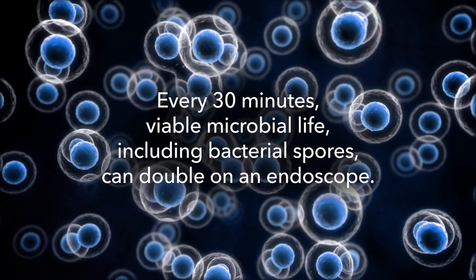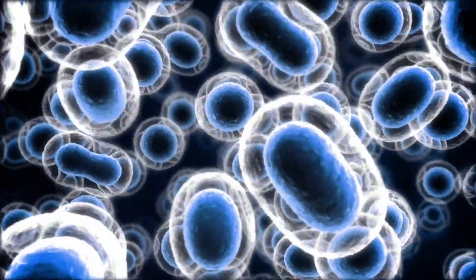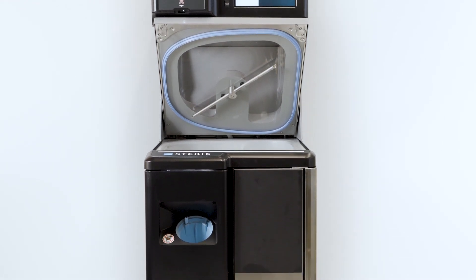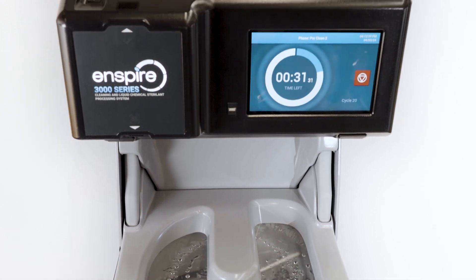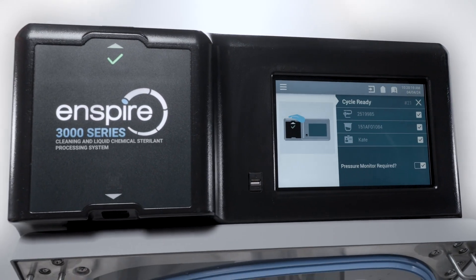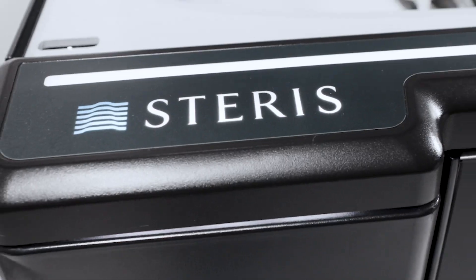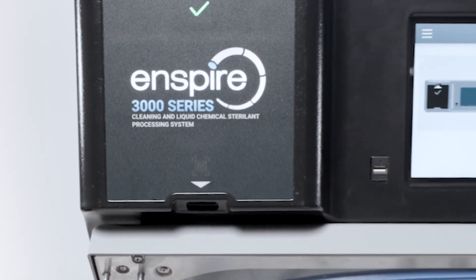Now, helping eliminate viable microbial life, including bacterial spores, begins with a wave of your hand. Introducing the enspire 3000 Series Cleaning and Liquid Chemical Sterilant Processing System — the first and only automated endoscope reprocessor delivering liquid chemical sterilization with a validated cleaning claim to help eliminate viable microbial life, including bacterial spores, on endoscopes.